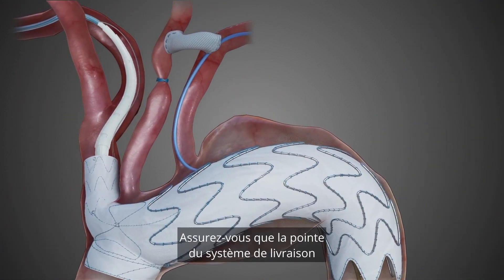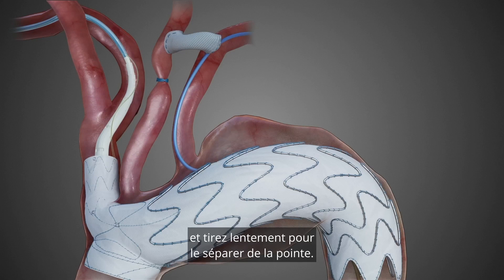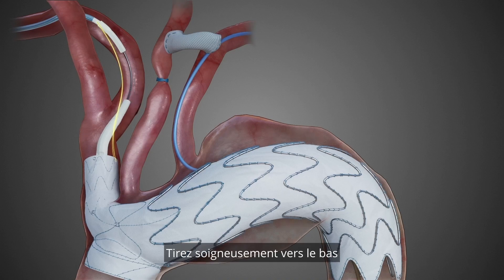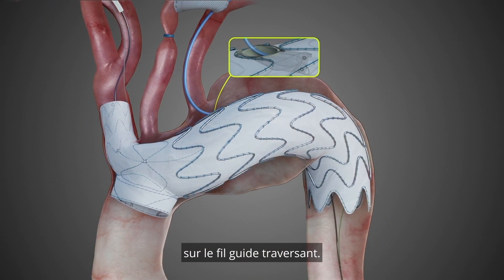Ensure the delivery system tip is pulled back into the BCT branch. Hold the blue fixation tube from the arm and slowly pull out to separate from the tip. Ensure a slight traction is achieved and keep this traction until the end of the procedure. Carefully pull down and remove completely the Nexus Duo delivery system over the through and through guide wire.